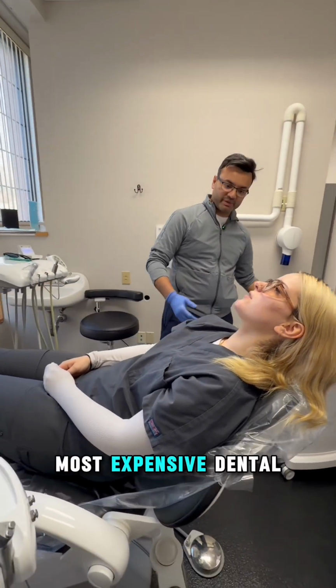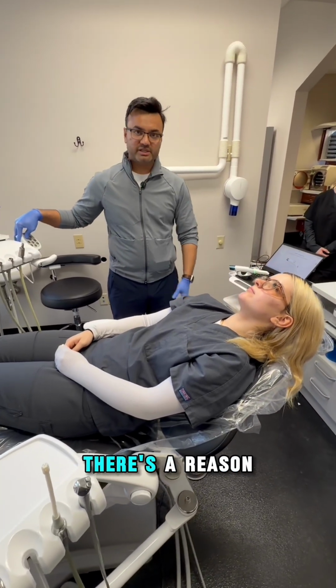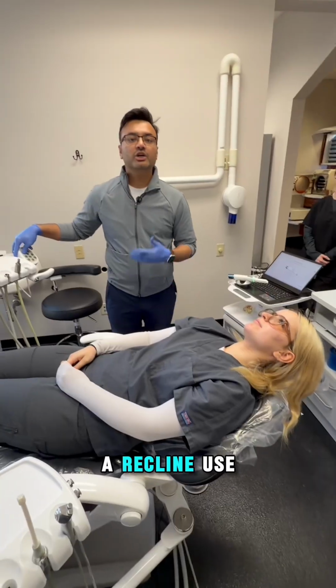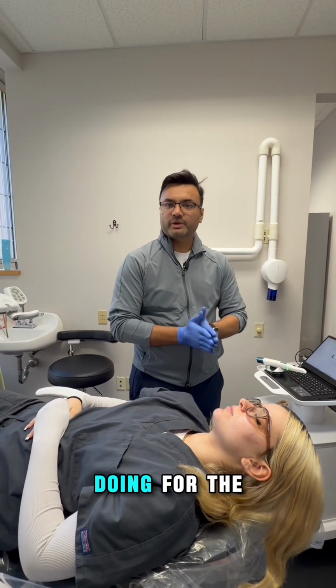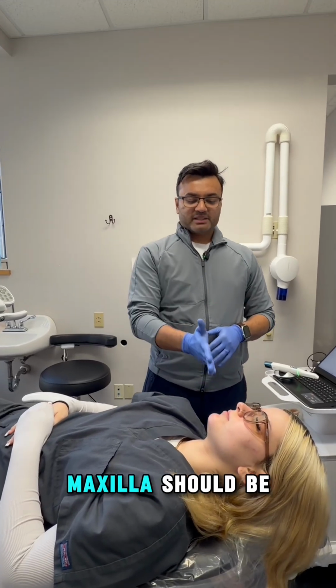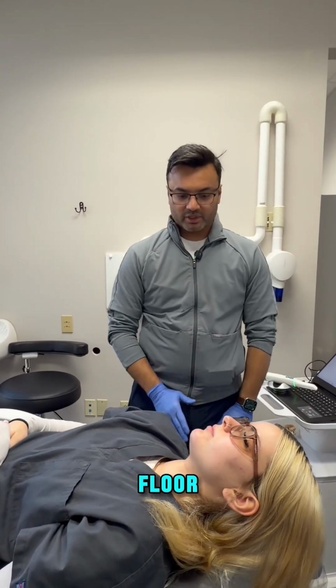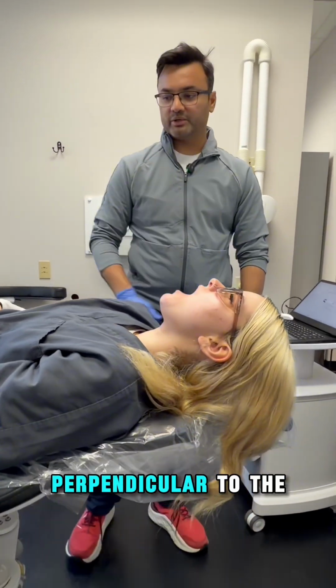We have the most expensive dental chairs in the world. We all know how expensive those chairs are. There is a reason why they give a recline. Use it. When the patient or any procedure that you are doing for the maxilla, if you want to make easy ergonomics, maxilla should be perpendicular to the floor. Open wide. So again, if you look at the maxillary arch, it's more or less perpendicular to the floor.